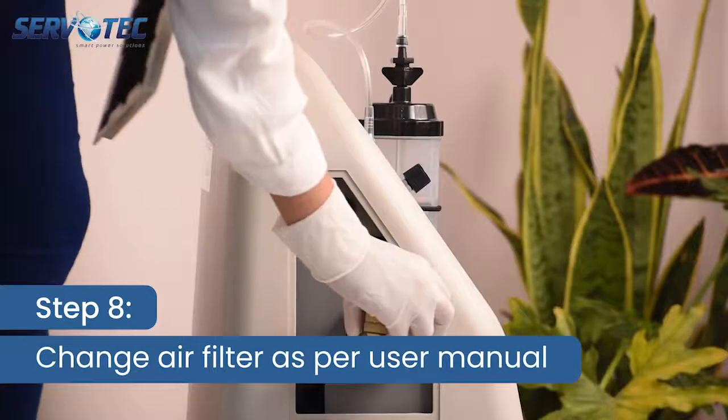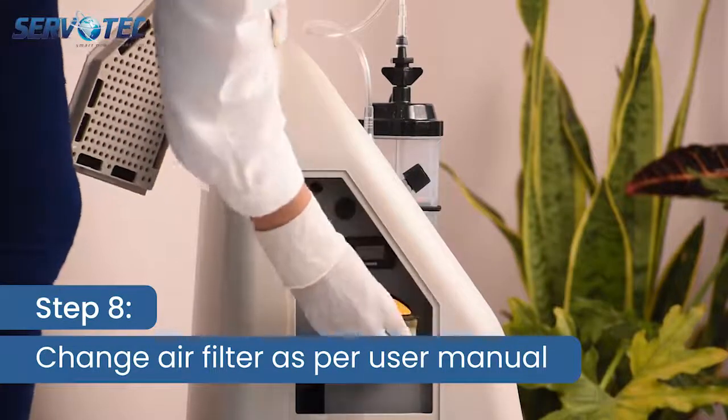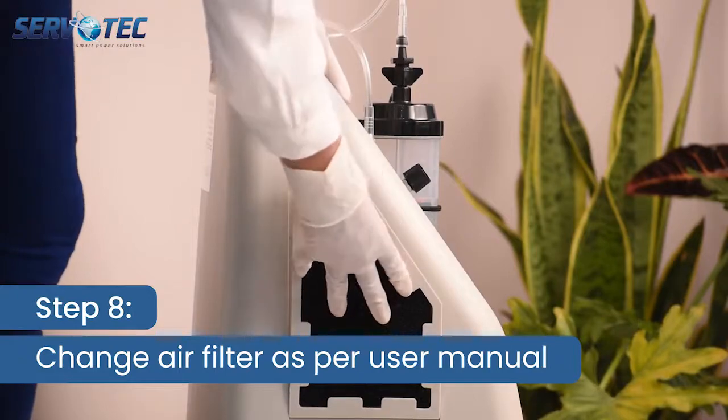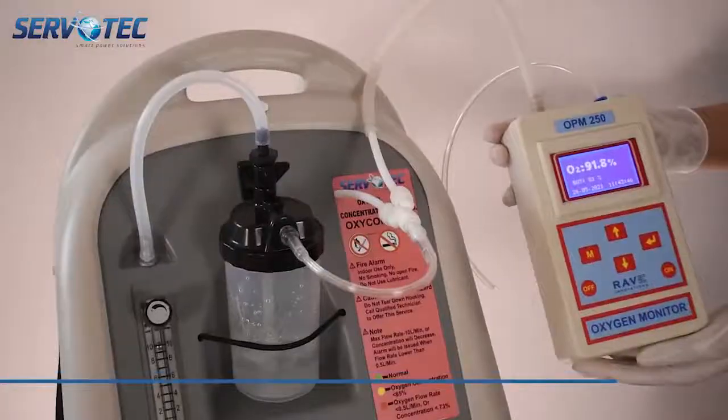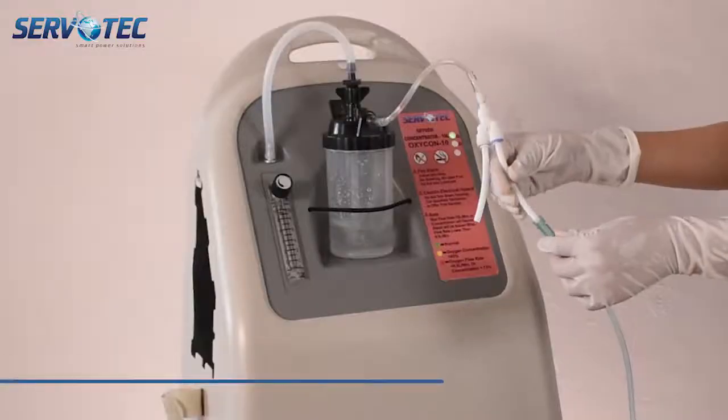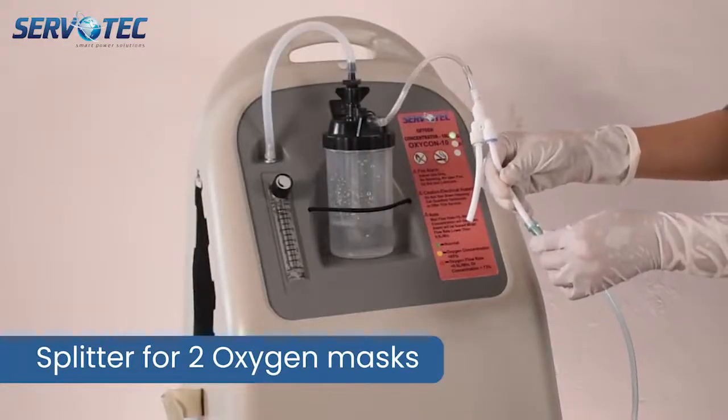Step 8. You can change the air filter as per instructions provided in user manual in specified intervals and can access as shown. This unit has 10 litre per minute capacity with oxygen output of more than 90% at all flow rates, also compatible with a Y splitter.